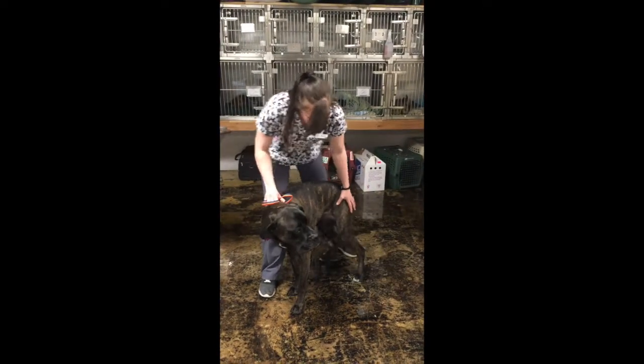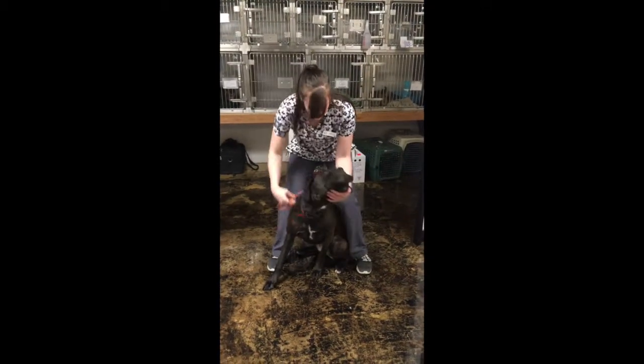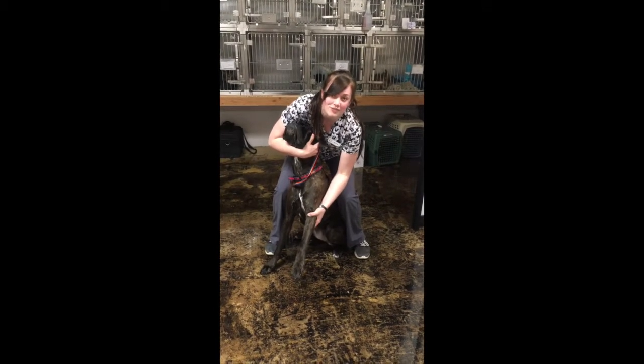Next, we're going to have Ellie sit down. Can you sit, Ellie? Good girl. I'm going to make sure I have her head in this arm, and then I would hold and roll this leg, and this gives the drawer access to the cephalic vein.